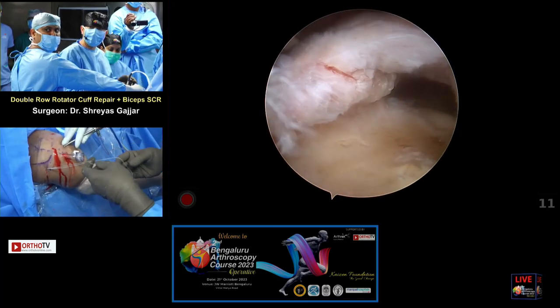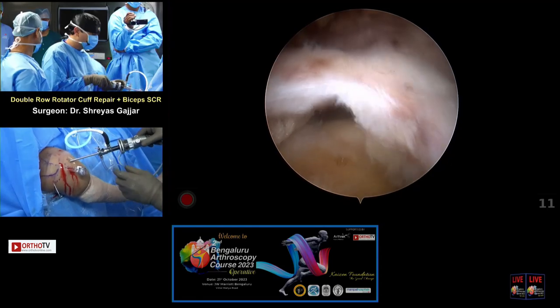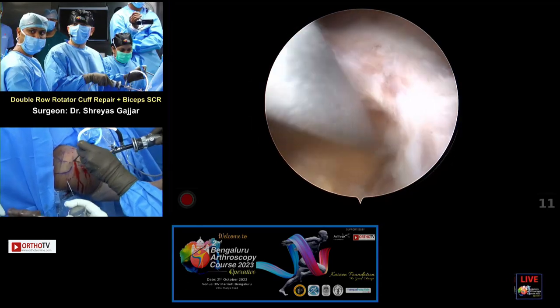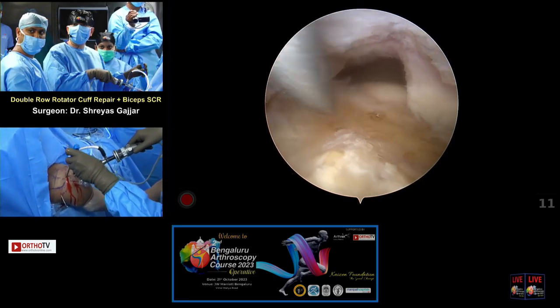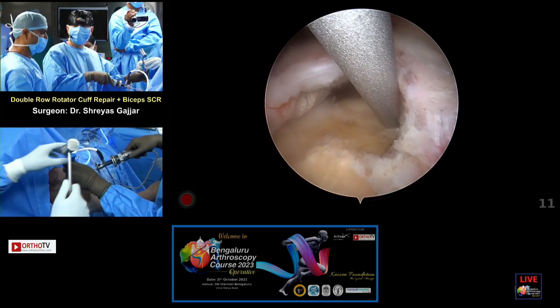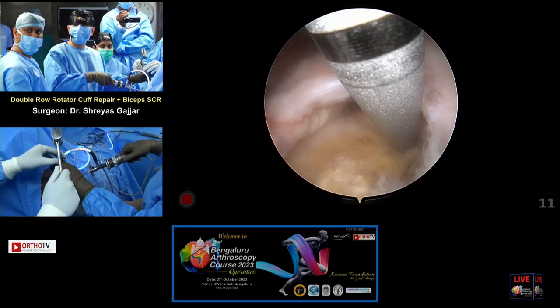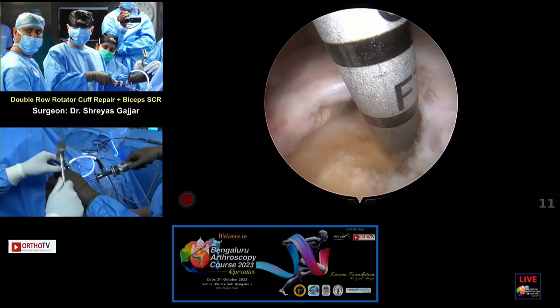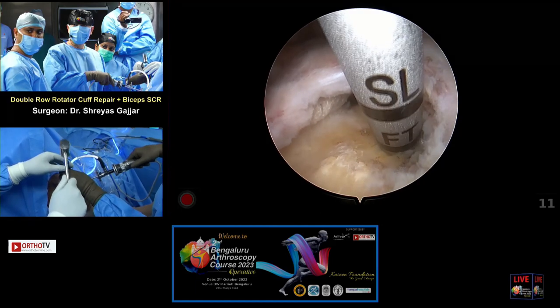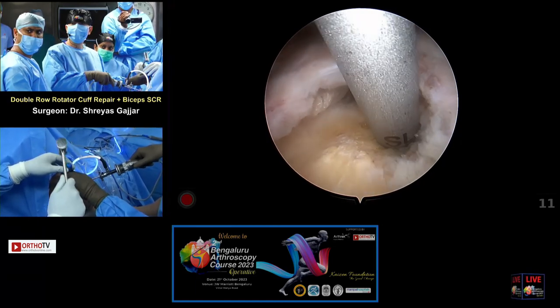Both the tapes are passed through the cuff. Likewise, I'll pass the second anchor. Can I have the punch, please? Thank you. Here, I need at least a 1.5 centimeter bridge. This is good enough, so I will pass it here. Gentle hammer first. A few taps to engage it, and then go. Good. The bone is soft, so go slow, please. Go slow. So you're quite happy with one point of fixation through the cuff?